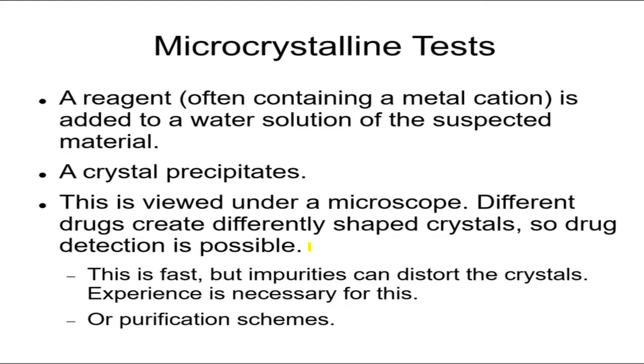However, remember, this is not necessarily pure, because we have criminals dealing with it, and they can put all kinds of garbage in there to dilute it, or because they're just messy. They don't believe in purity the way people do in a chemistry laboratory. So you can find all kinds of impurities there, and you never know what might distort the crystal from being the correct shape. If you're a professional, you can know, oh yeah, it's not the right shape, but I can see what's distorting it.